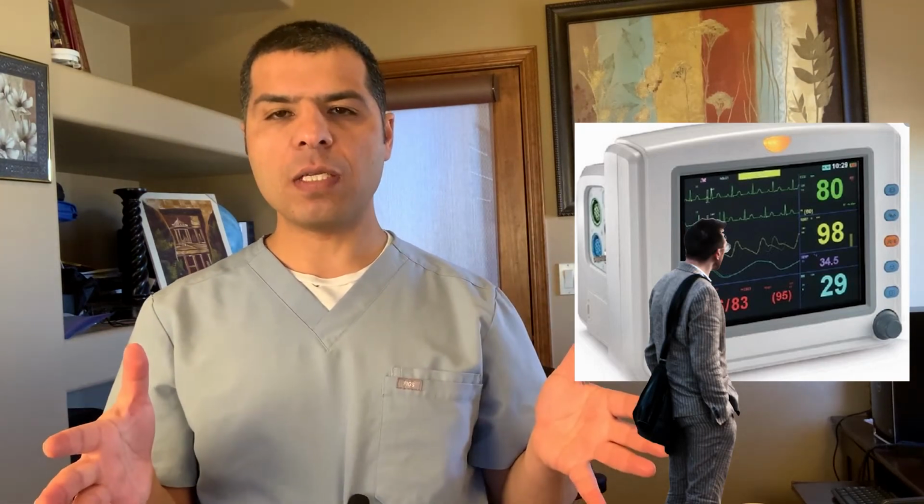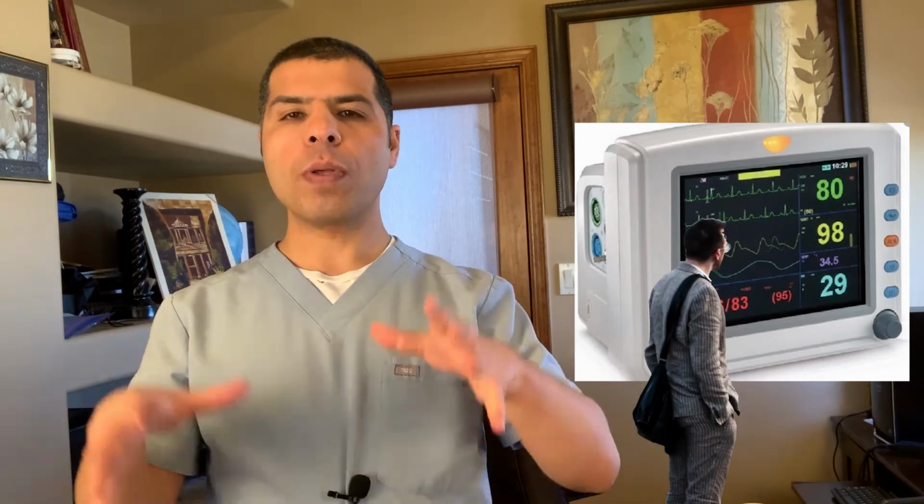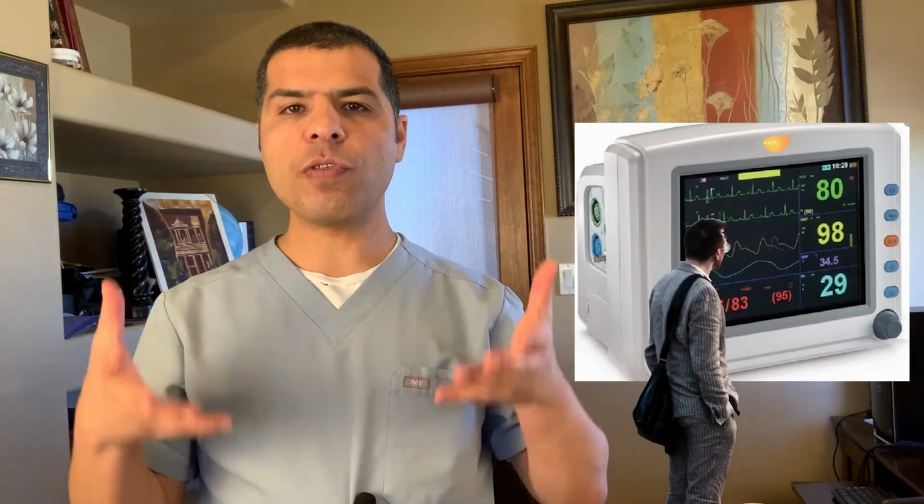Remember that very well. That's why you need to assign someone to update you, because you can easily get distracted while you're trying to find the vocal cord and insert the ET tube. Do not keep trying. Pull the laryngoscope, bag the patient again, improve the oxygenation, and then try again.